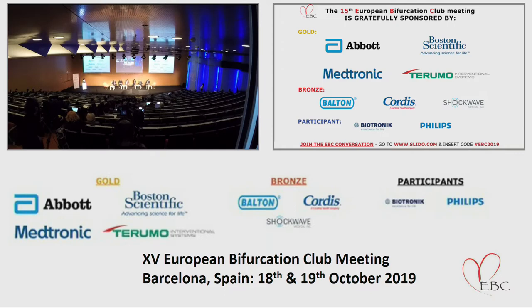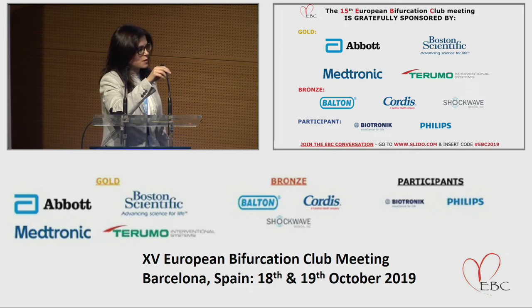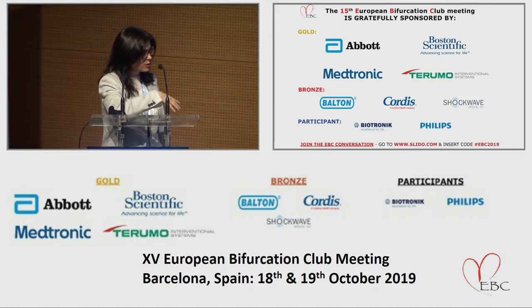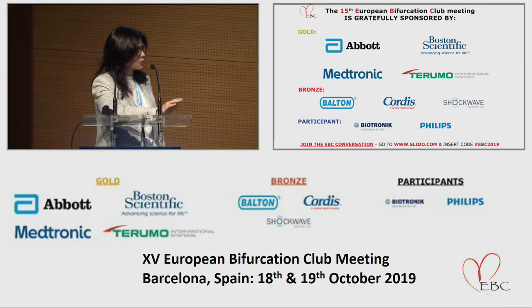I think we are in the process of learning with techniques that are appearing now, like shockwave, for example, because one thing that looks quite clear from the cases we have been doing is that there are different types of calcium, and the effect of the different techniques on the different types of calcium is different. It's not the same having a ring of calcium than having a calcified nodule. So I think we are in the process really of learning which technique is better for which type of calcification. I don't think there is an algorithm already established for that.